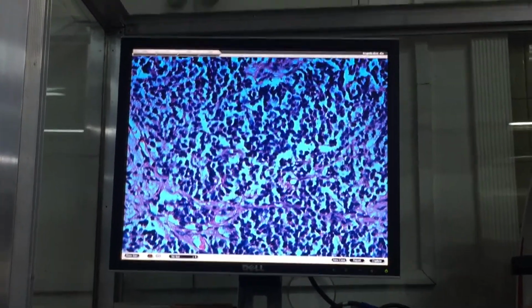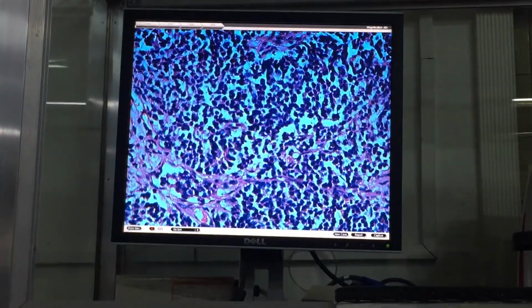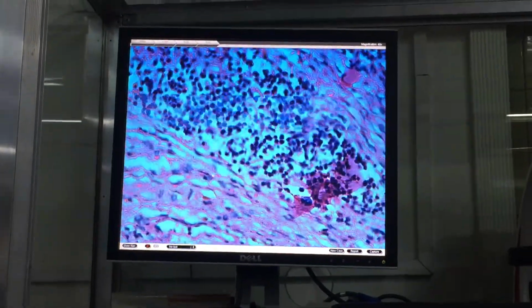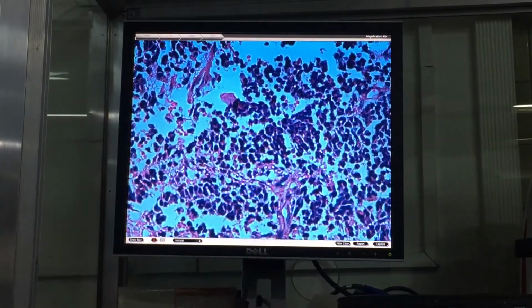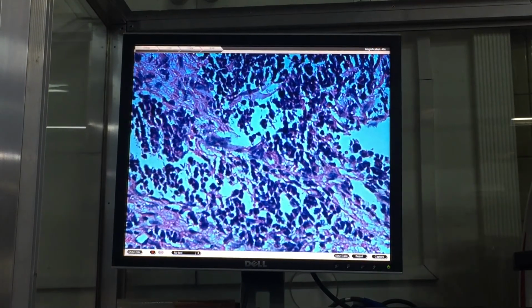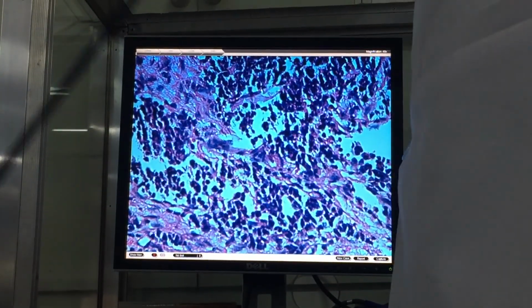Okay, this is also epithelial cell. Medyo a little bit of your imagination is needed. Under the microscope, this will be clear. Okay? I think that's it for your renal. Good luck.